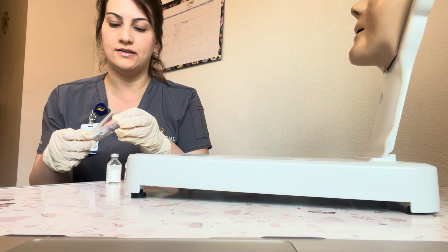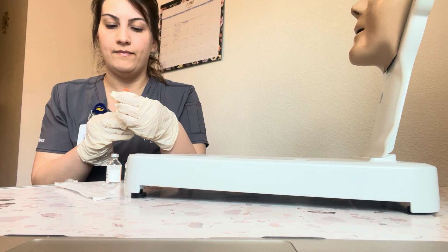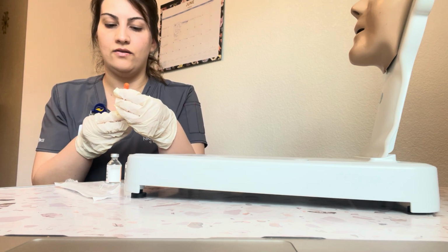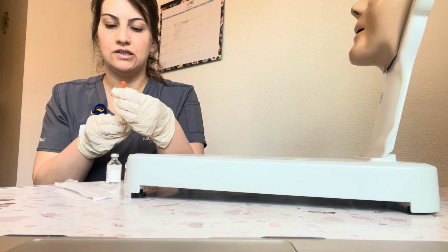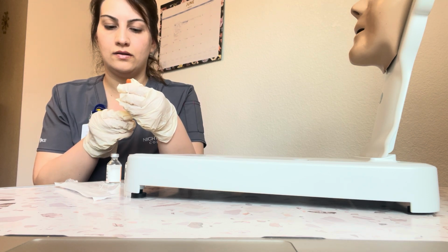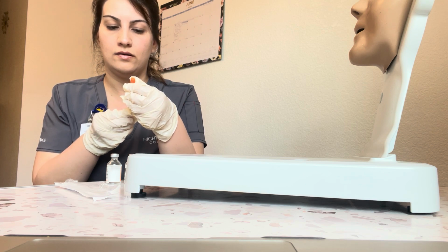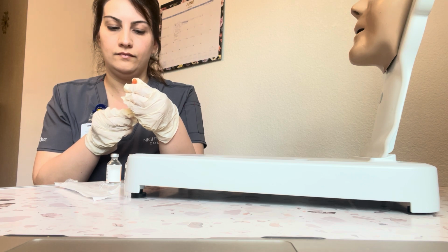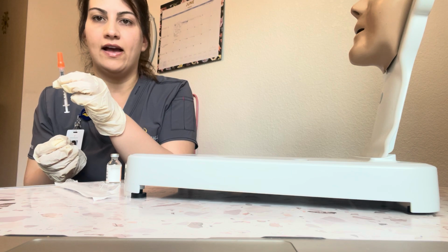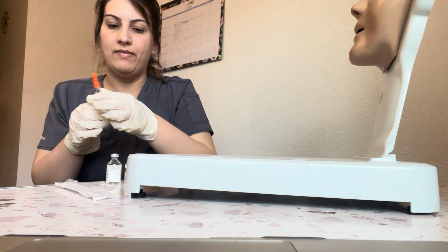So I'm going to get started by getting the 8 units of intermediate. Nurse and I verify against the mark 8 units of air for my patient.